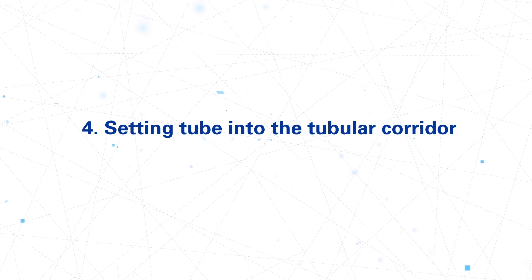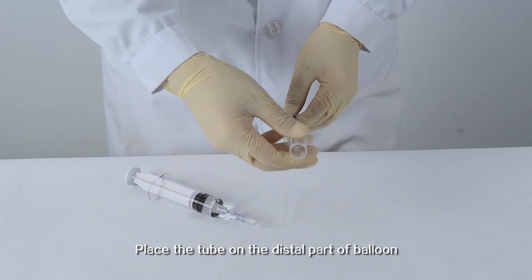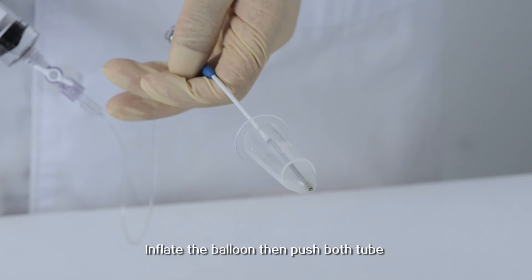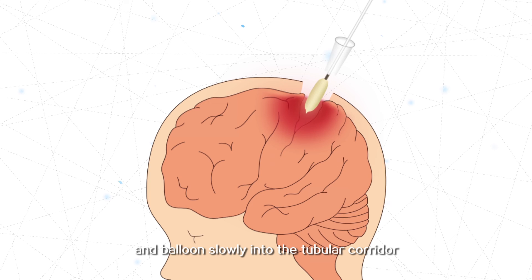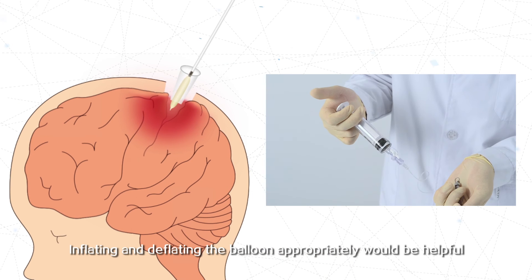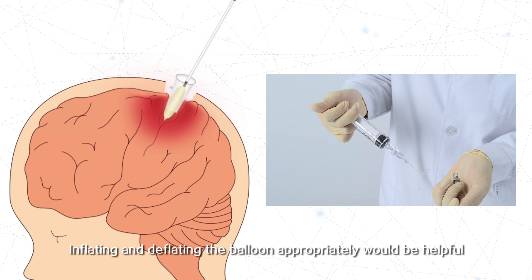Step 4: Setting the tube into the tubular corridor. Place the tube on the distal part of the balloon and inflate the balloon. Then push both tube and balloon slowly into the tubular corridor. Inflating and deflating the balloon appropriately would be helpful.